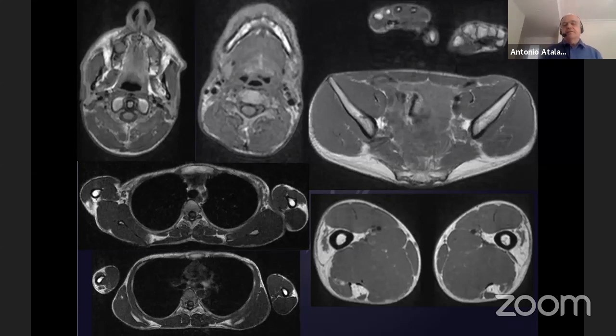It's that for the future of having the means to run clinical trials, we will need to have biomarkers, and potentially the MRI offers several points where we have measurable alterations, and we can repeat the test over time. It's not as cumbersome as doing muscle biopsies.